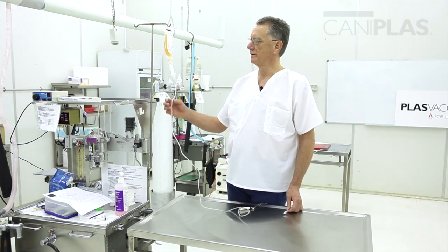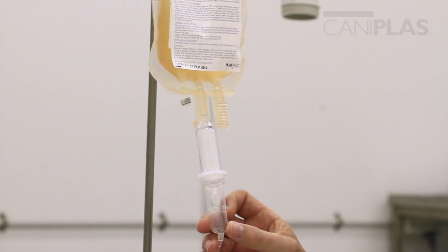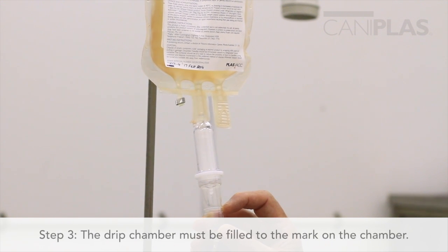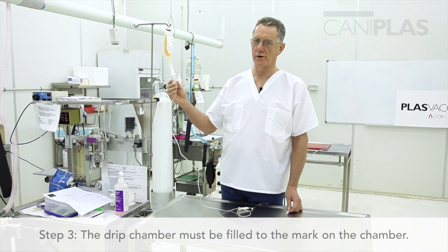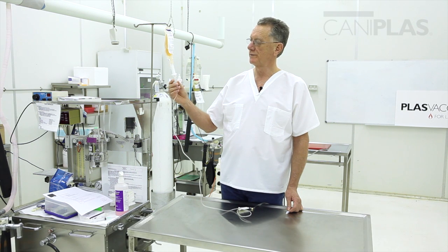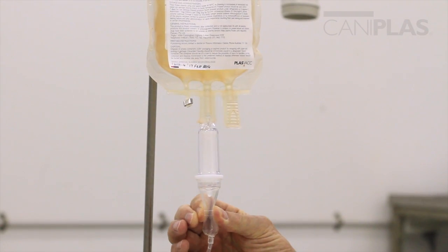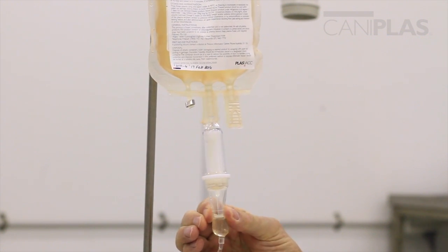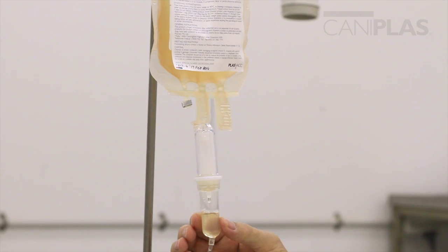Now we're ready to fill our drip chamber. We've got our plasma hanging on the drip stand, and the drip chamber must be filled to the mark put there by the manufacturer — that's optimum. If there's too little plasma in the drip chamber we'll get a froth forming; if there's too much we won't be able to see it running. I'll gently squeeze the drip chamber now — we'll see some plasma running in, and that's about ideal.